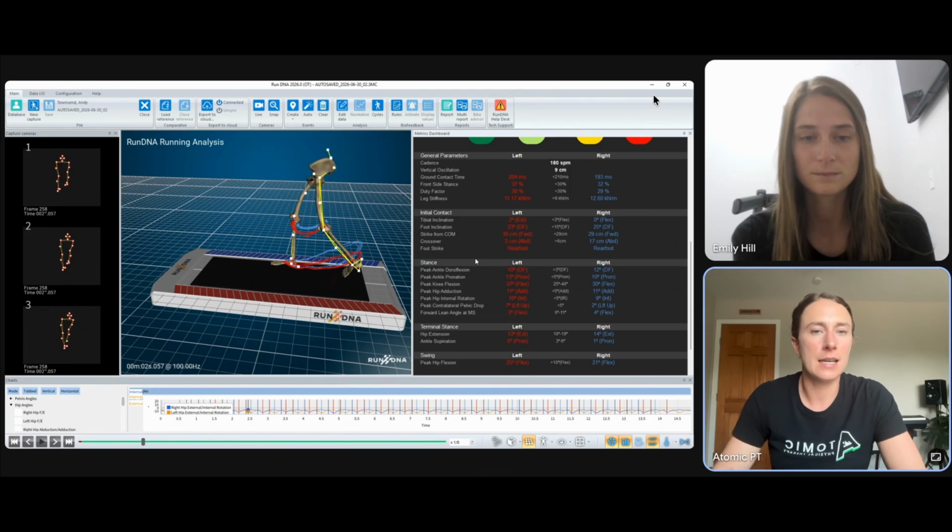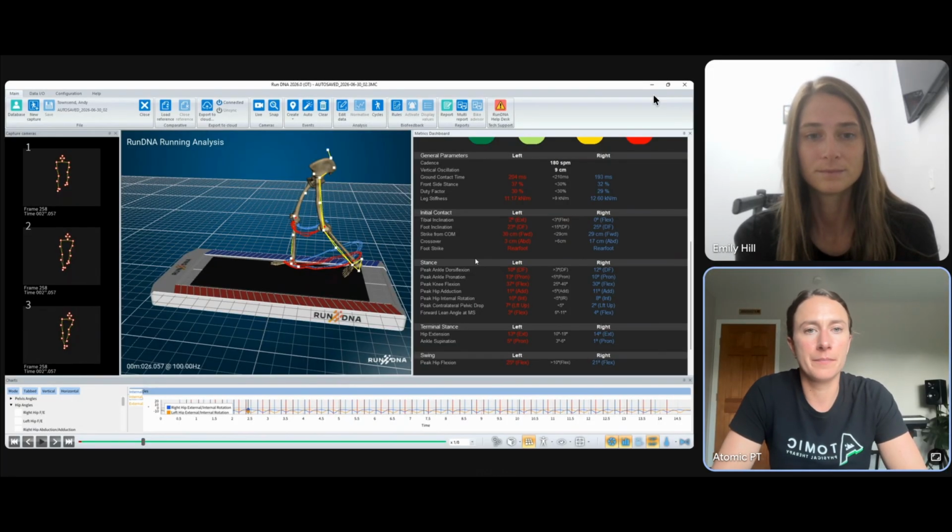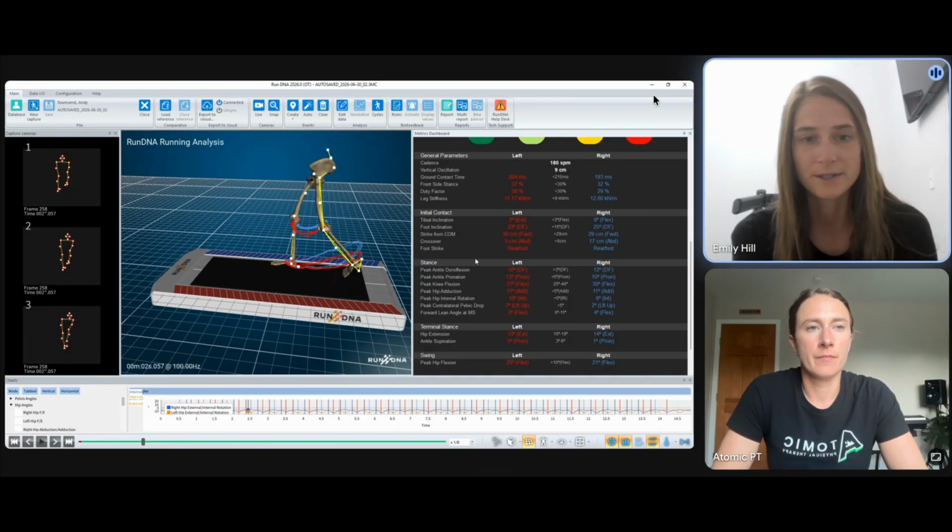The patient is getting a very comprehensive idea of what they need to work on, and then at the follow-ups we can really address how much better has this gotten, if it has or hasn't, why is that the case, and how do we proceed forward. Yeah, a lot more comprehensive without any of the guesswork.